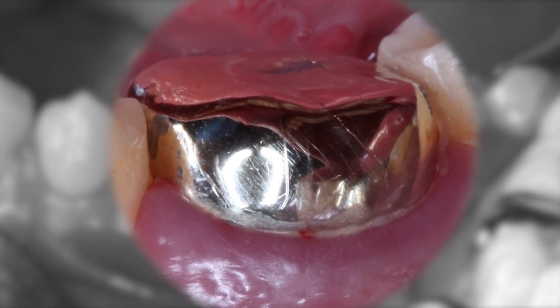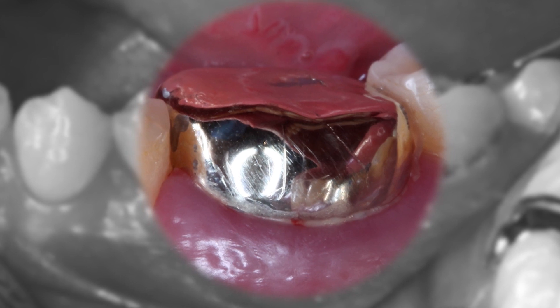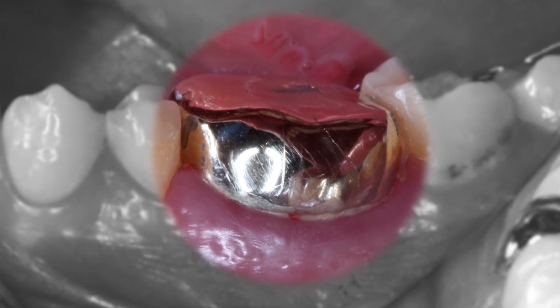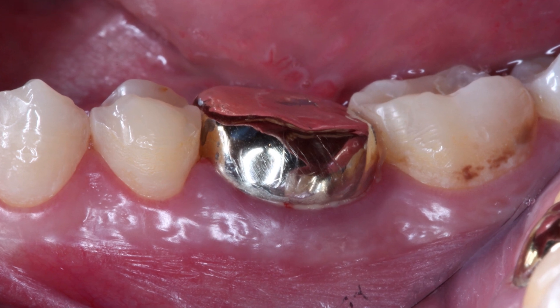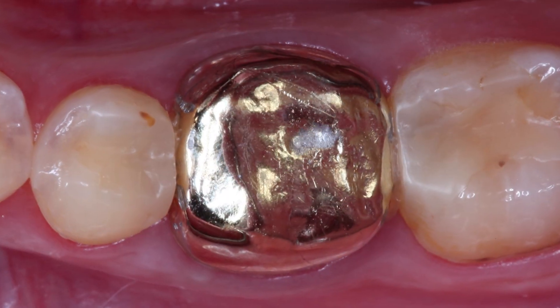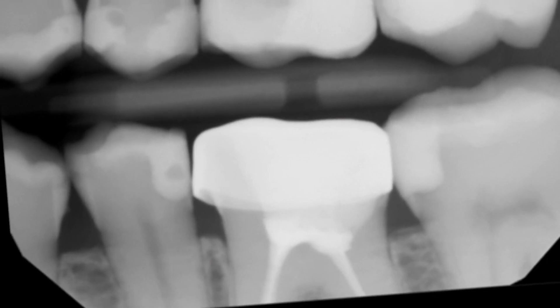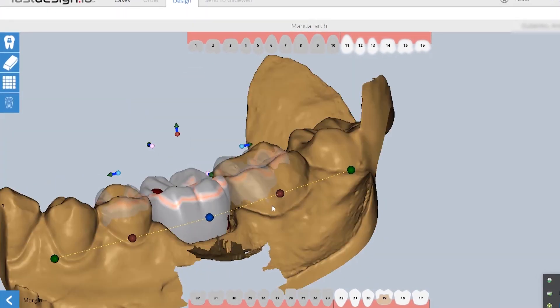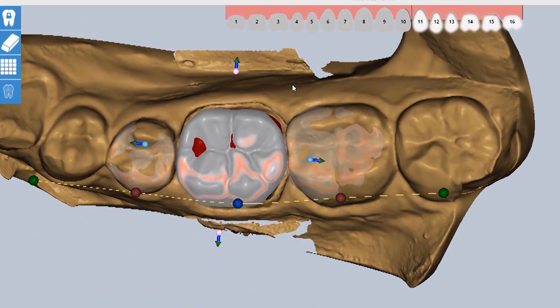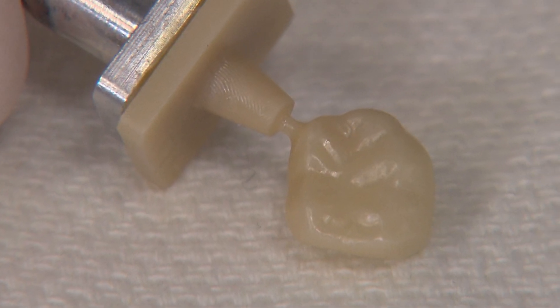We have a 28-year-old male whose chief complaint is pain and bleeding gums around the crown in his lower left quadrant. He presents with a full coverage gold crown on his mandibular left first molar, tooth number 19, that has localized gingivitis characterized by swollen purple gums around the crown. The over-contoured crown with an extensive overhang is the primary cause. The plan is to replace the crown with a same-visit restorative approach utilizing the Glidewell.io chairside system.